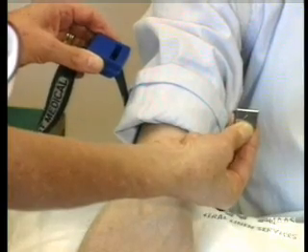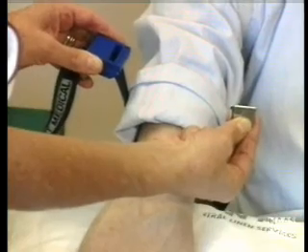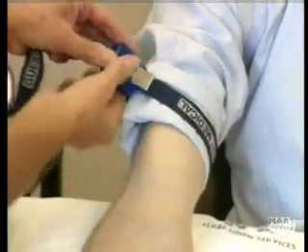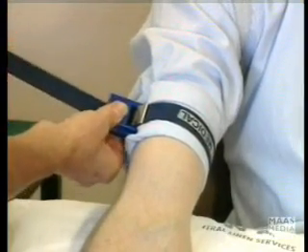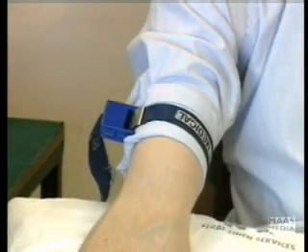The phlebotomist is going to take some blood from me. First of all, she's going to put the tourniquet on — just watch how this is done. You've linked it together, and because it's elastic, you pull on it so that the venous return is obstructed.